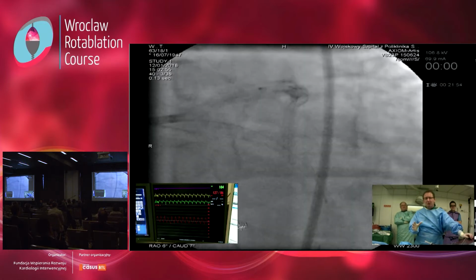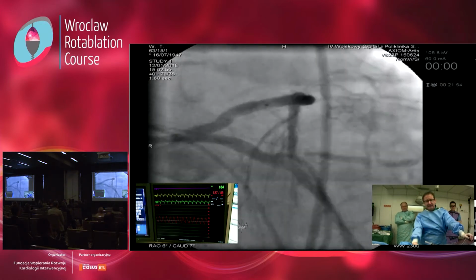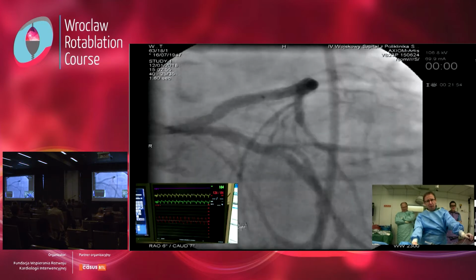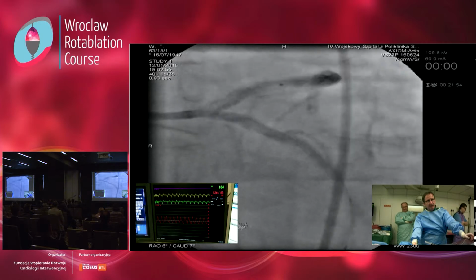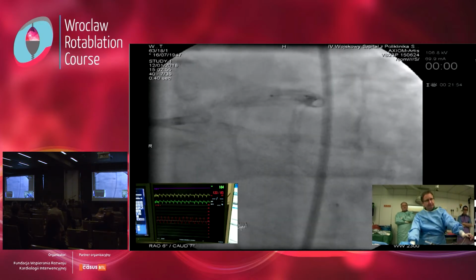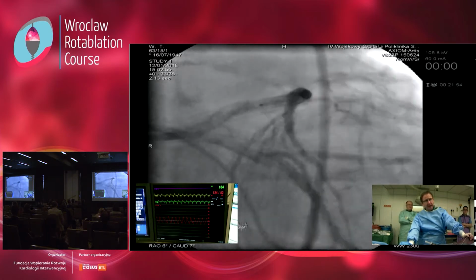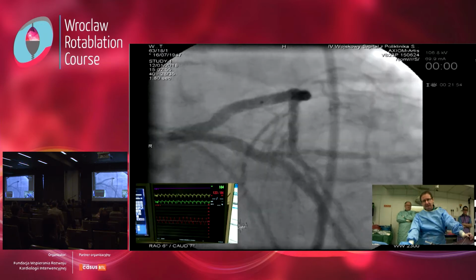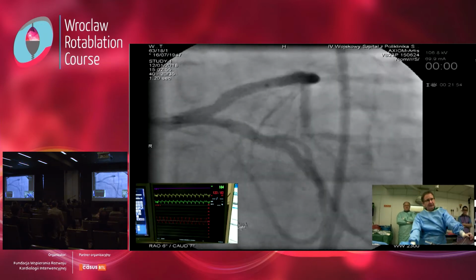And so what we have done then, very fast stenting from the left main to proximal LAD with 4.0, I believe it was 4.0 by 28. And already we were lucky to have wire in the circ. So then at least this was safe.